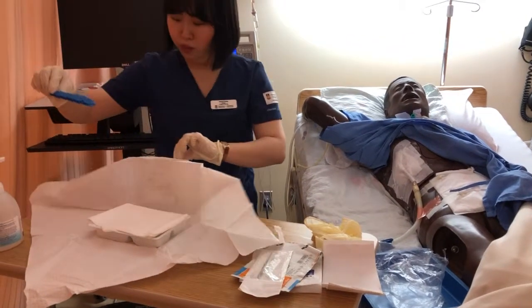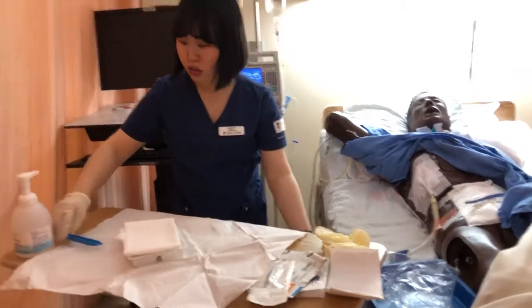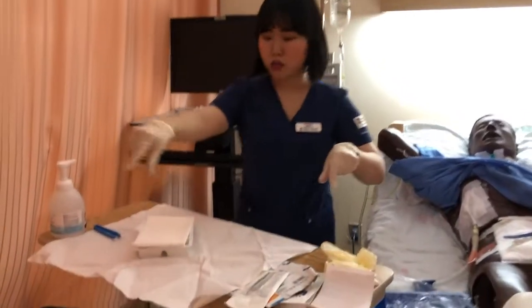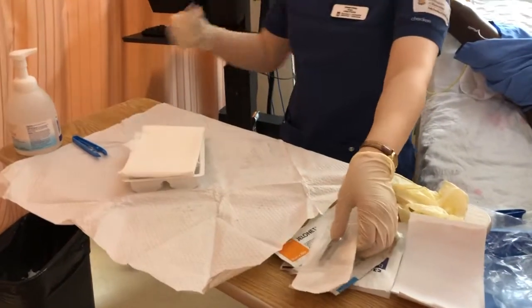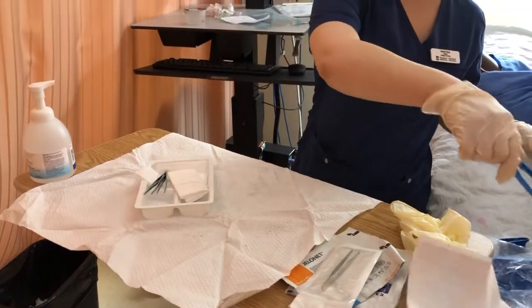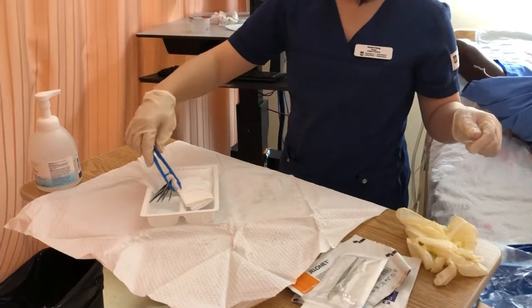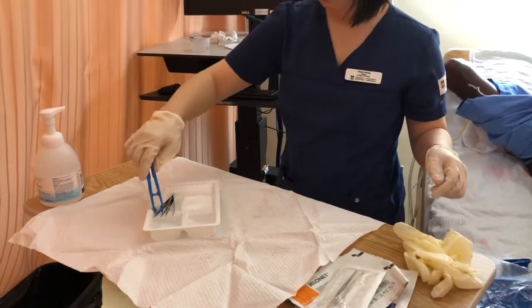I have my blue forceps here, and I'm aware of the sterile field around the 2-inch border. Anything below my waistline is considered unsterile. I'm going to use my blue forceps to take the outer dressing out here.